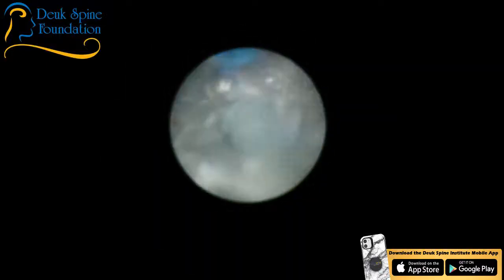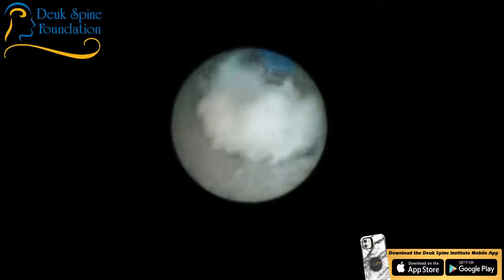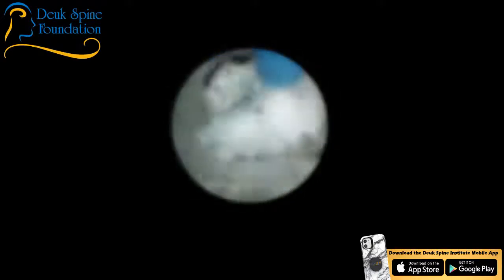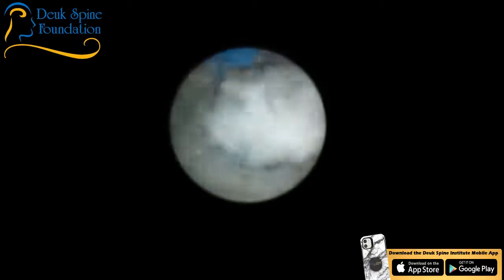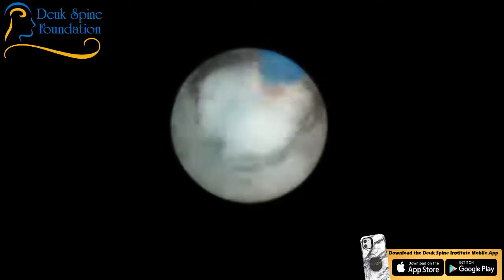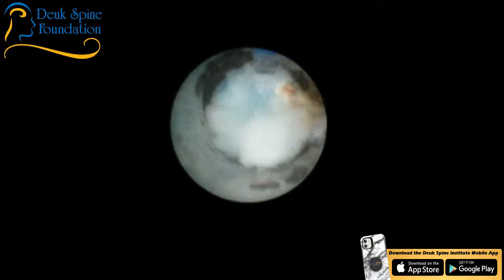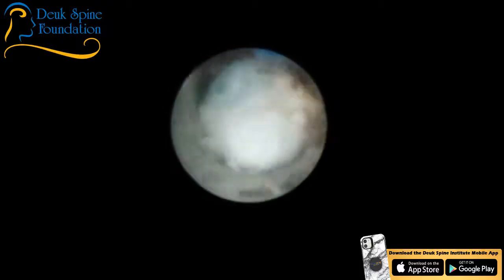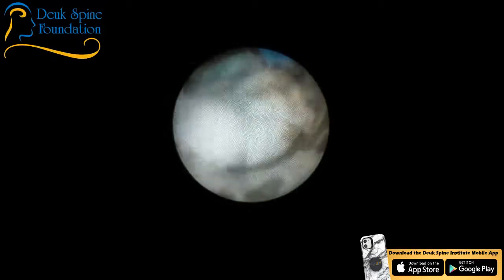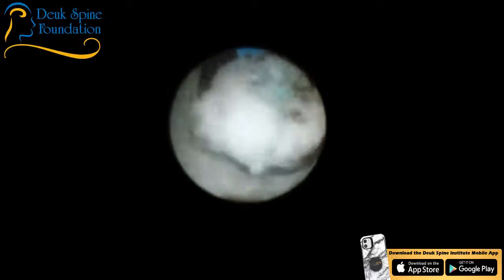Like being at the base of an iceberg. What is an iceberg? It sits in the ocean. Right, so you're underwater and you're looking up at the bottom of an iceberg with the tip of it sticking out. You're a scuba diver or somebody with really good lungs. And you're just whittling away at the bottom of the iceberg until you pass through the whole iceberg and you get to the tip. That's what it's like. I'm working at the base of the herniation, and we're going to follow it right through the surface of the ocean.